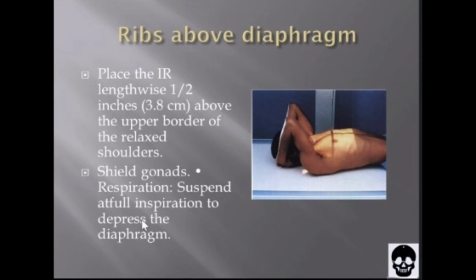Gonad shielding must be used. Respiration is suspended at full inspiration to depress the diaphragm.